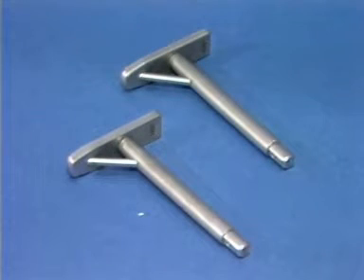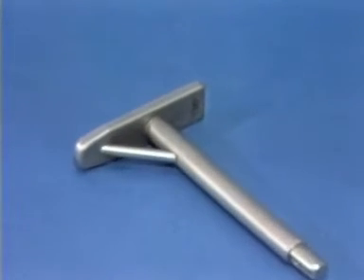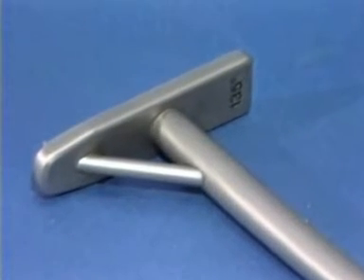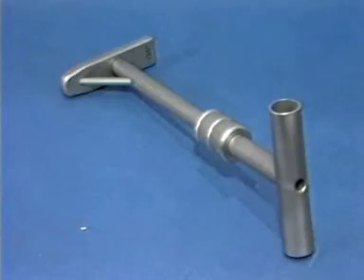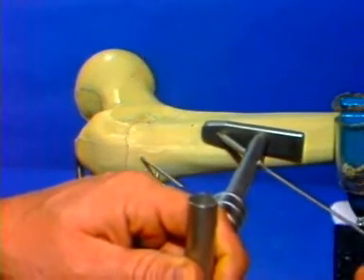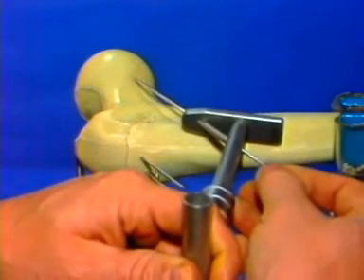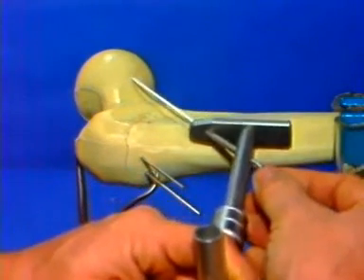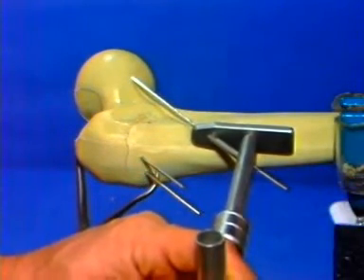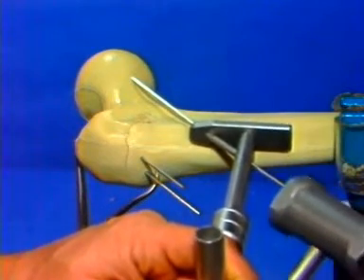We would now estimate the neck shaft angle. For this exercise, we choose an angle of 135 degrees and so select the appropriate guide. We next place a guide wire anterior to the neck and hammer this into the head using the appropriate angled guide to provide a measure of anteversion of the femoral neck.